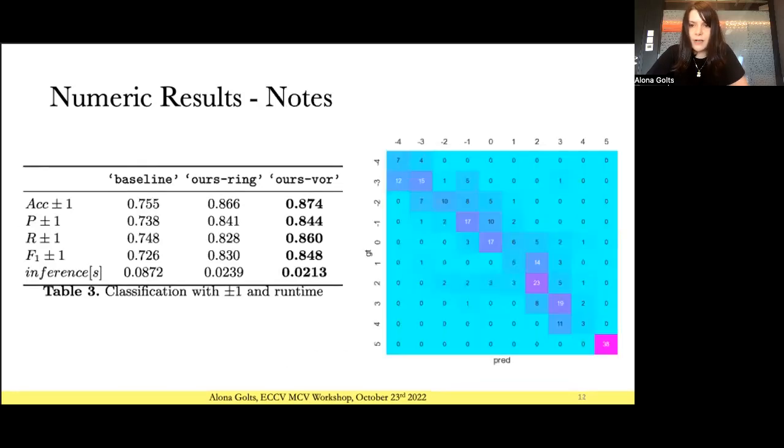Another issue we have discovered is that of intra-annotator confusion. One can see a confusion matrix on the right showing the performance of our method. The most common mistakes of the model are between adjacent classes. This can be expected since class 2, for example, is very similar to class 3. Thus, the original annotation data can be noisy. On the left, we can see the F-score if we disregard misclassifications from ±1 adjacent classes. One can see a better F-score reaching almost 85%.